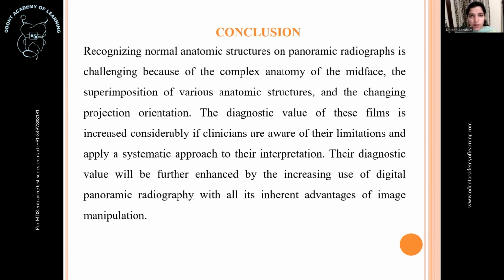The diagnostic value will be further enhanced by the increasing use of digital panoramic radiography with all its inherent advantages of image manipulation. With the introduction of 3D imaging along with 2D imaging, the diagnostic area has improved to a greater degree.